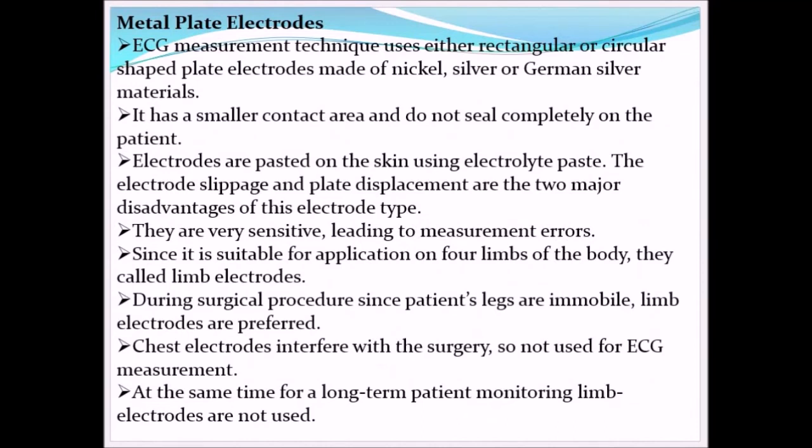In many movies you can see that to check the growth of the fetus in the womb, they use the ultrasonic method, and for that they use the electrode paste.